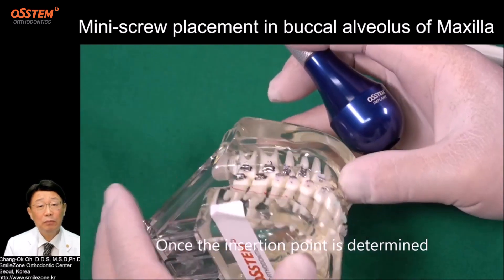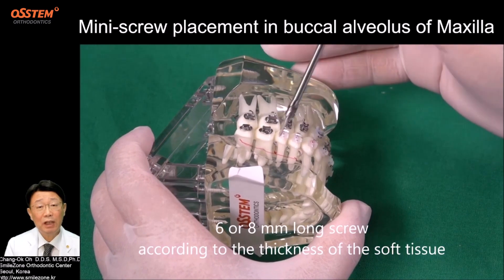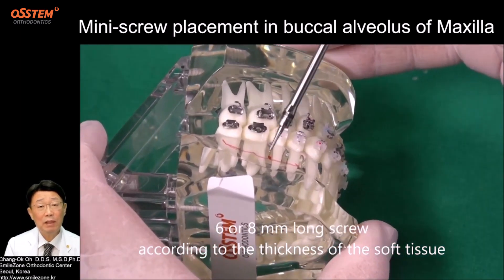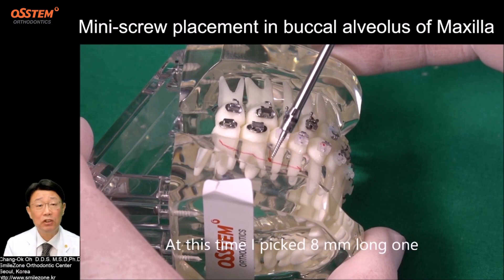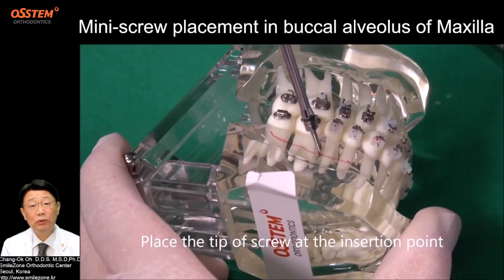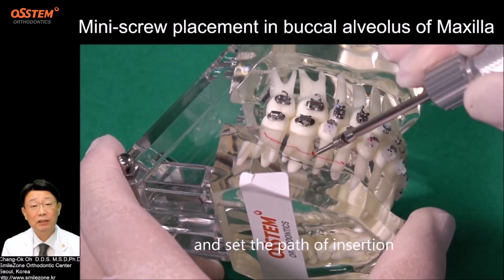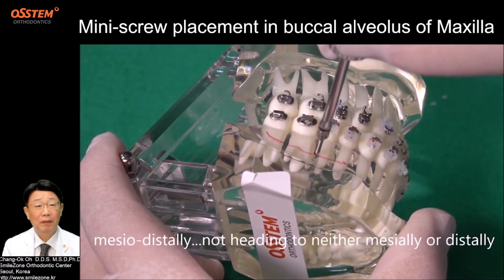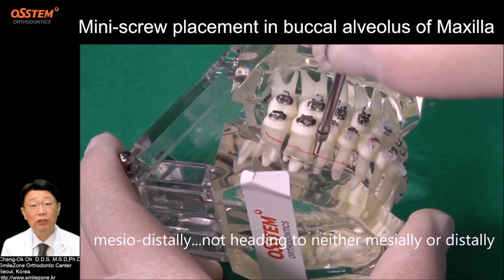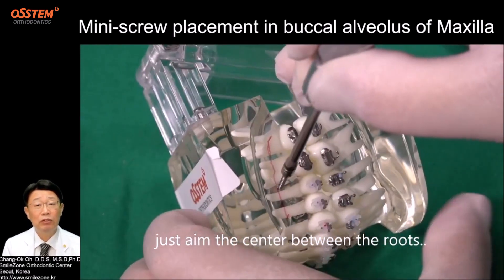Once the insertion point is determined, pick up a 1.6 mm diameter, 6 or 8 mm long screw according to the thickness of the soft tissue. At this time, I pick the 8 mm long screw. Place the tip of the screw at the insertion point and set the path of insertion — medio-distally, not heading medially or distally, just aim the center between the roots.